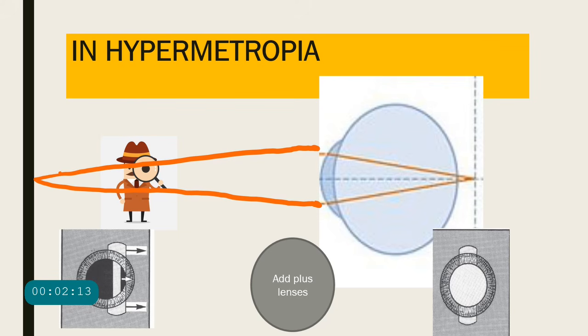and then you will get the neutralization point. So suppose you get the neutralization point at about plus 2 diopters. Again, you have to subtract the working distance of 1 diopter. So the net hypermetropic error that you get is 1 diopter.